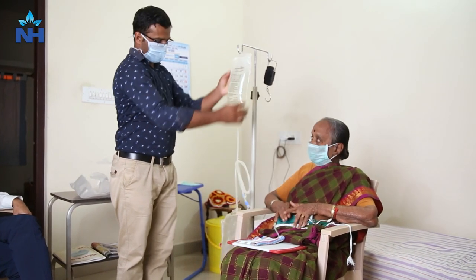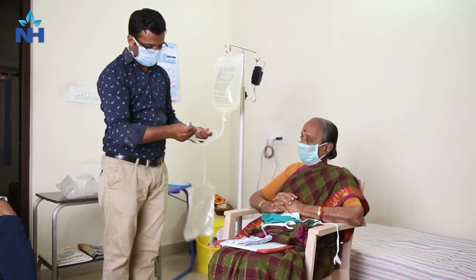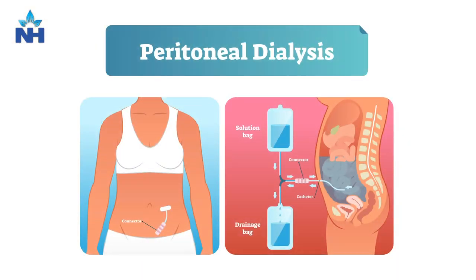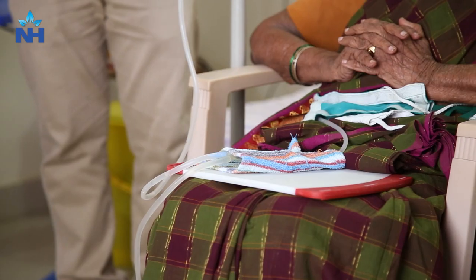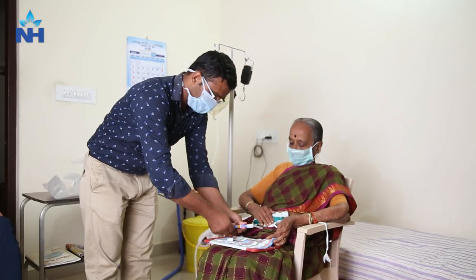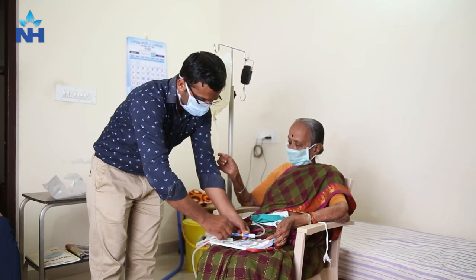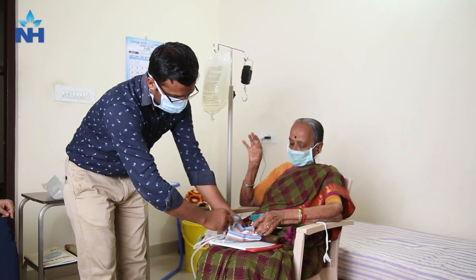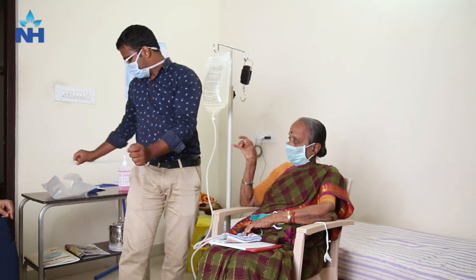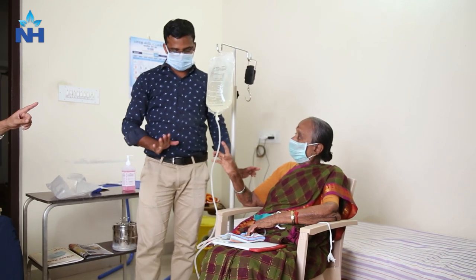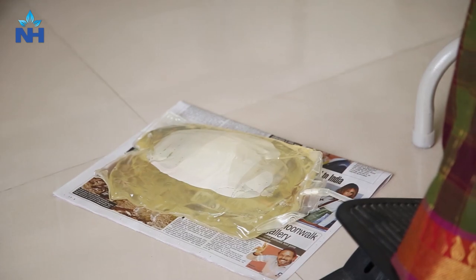I would request Vamshi to start the process while I talk about it. The peritoneal dialysis catheter — a catheter comes out from the tummy. The inner part of the catheter goes inside a cavity in the abdomen called the peritoneal cavity, and the outside part is what we are seeing here. Vamshi is connecting the outer bit of the catheter to the bag, which has two parts: one is a fluid-filled bag, and the other is an empty bag.